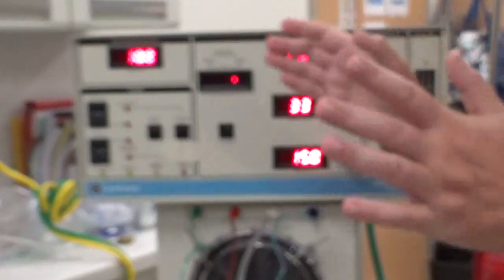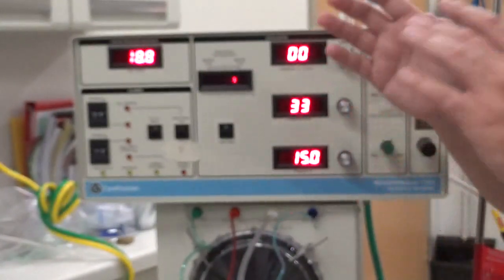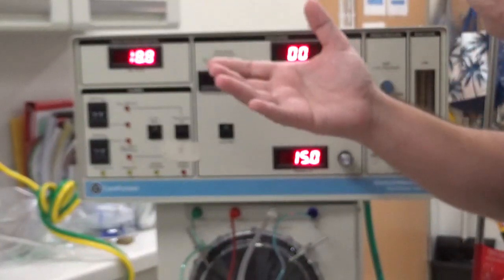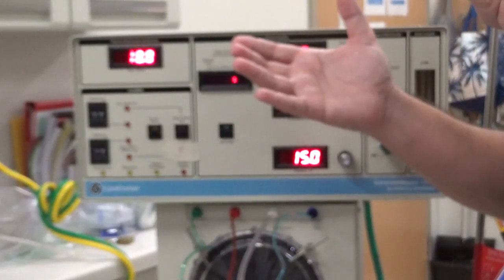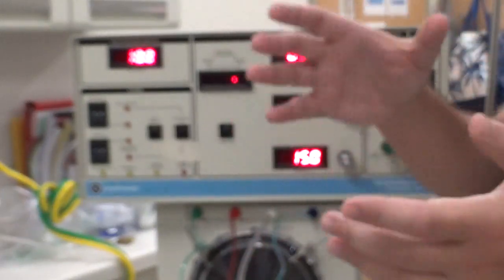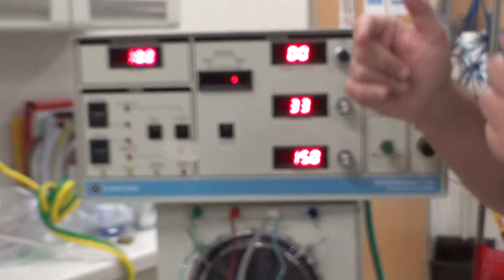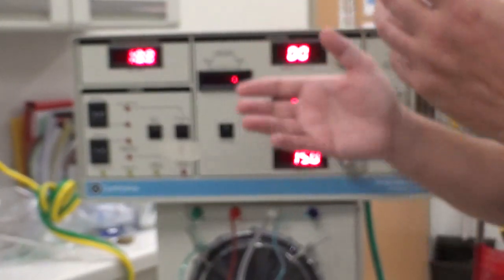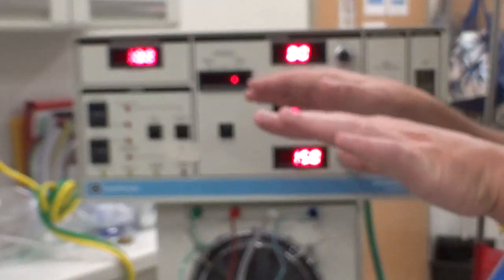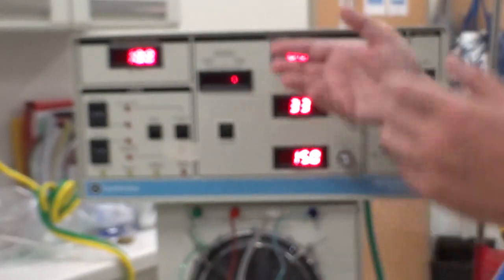There's a lot to go into about what kind of MAP you want. Like I said earlier, it depends on whatever it is on the conventional ventilator; you want to be about the same or a little bit above. It also depends on the X-ray. If you've got flat diaphragms, your mean airway pressure is probably a little too high, so you want to turn it down a little bit.